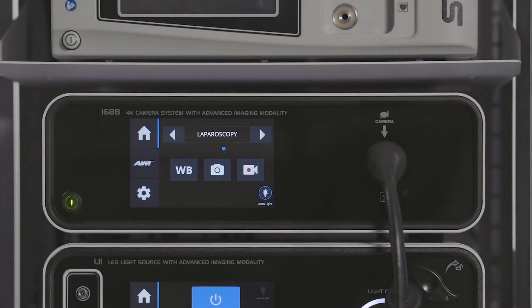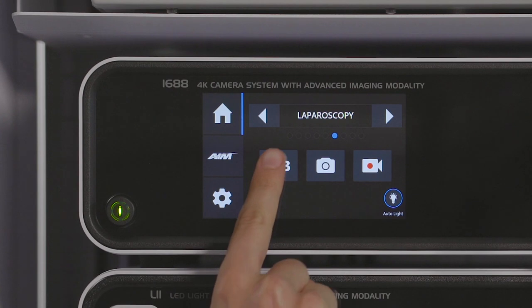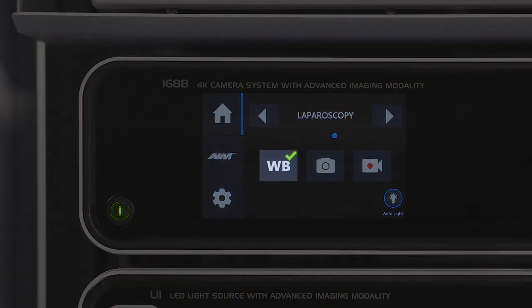Before white balancing, point the scope tip at any clean white surface like stacked white gauze pads or laparoscopic sponges. Press and hold the icon labeled WB to initiate white balancing.